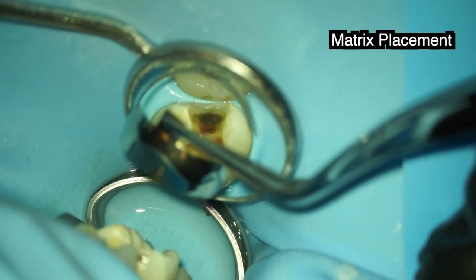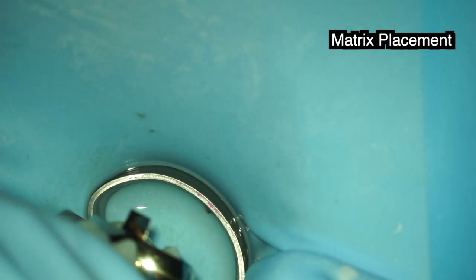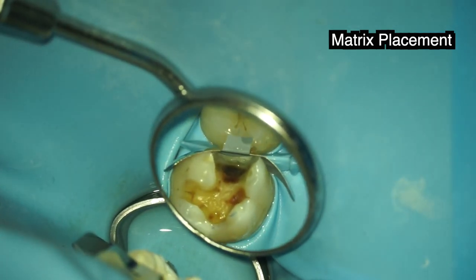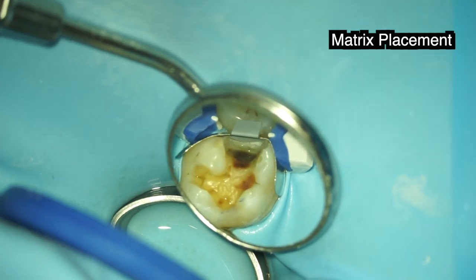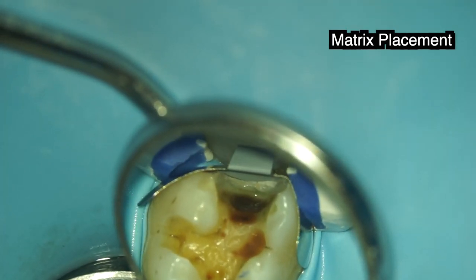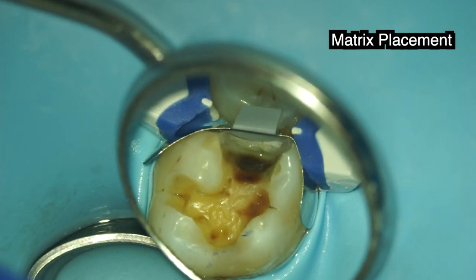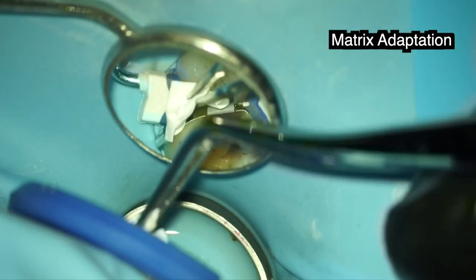The next step is the placement of a matrix. This makes sure that we can have a good contact point between the filling and the neighboring tooth. The matrix is now in place, but it needs to adapt a little bit better, hence I am using some Teflon tape to put it better into place.